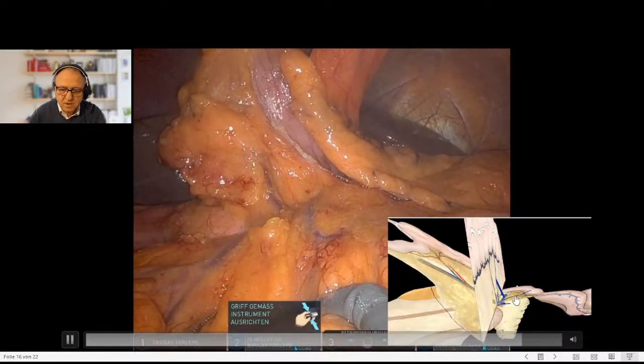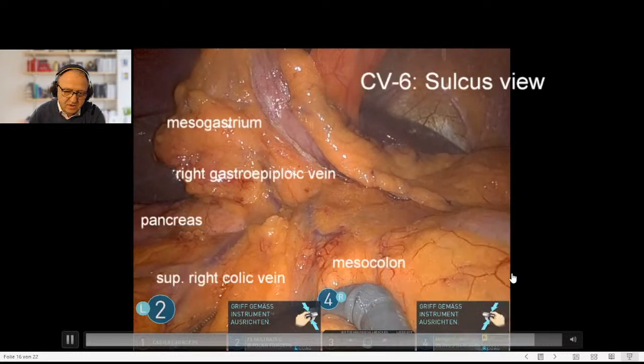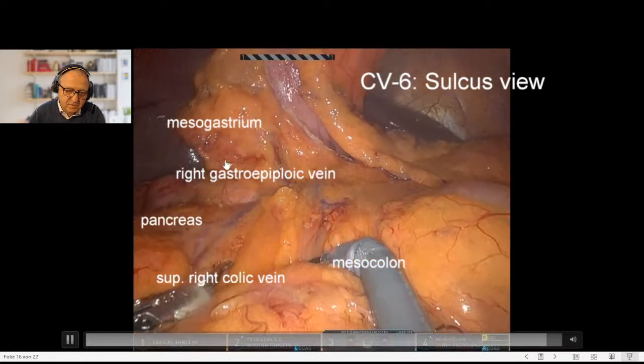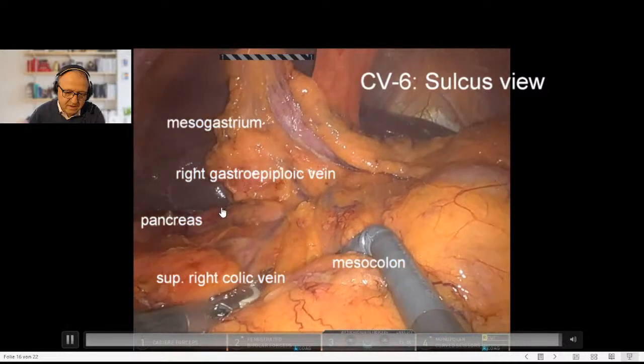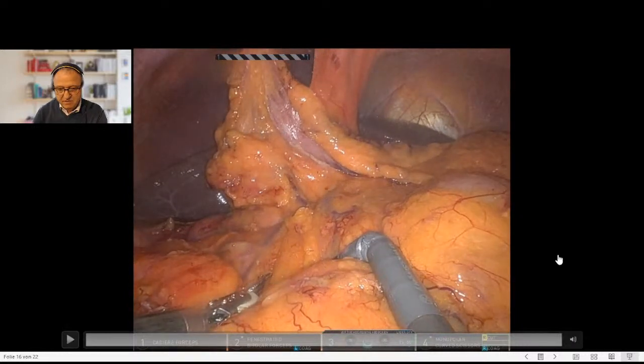These are the last adhesions to the duodenum. And this is the sulcus view as you would see it here: mesogastrium, the gastroepiploics, pancreatic head, and the colic vessels.